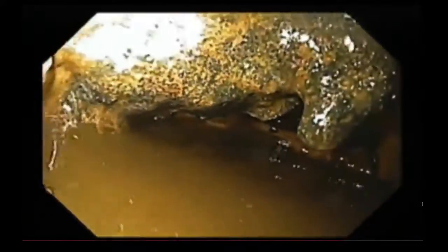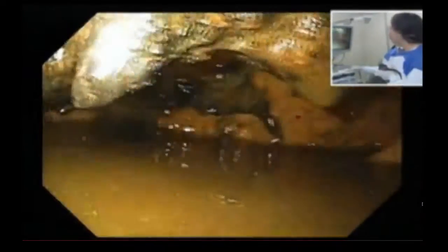So what I do always is afterwards I irrigate. What I call vigorous irrigation, and clean it out just like you treat a wound, debridement principle. And then I put H2O2, hydrogen peroxide, at the very end. So a very nice image of the cyst here. You can see some of the debris. And we're using the stent as a port.